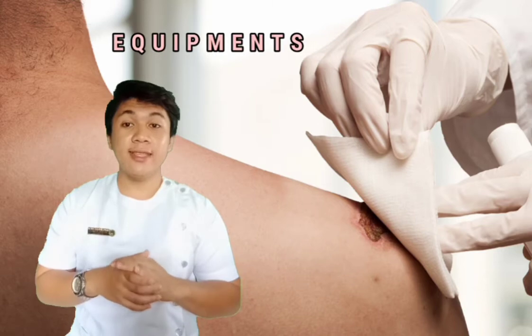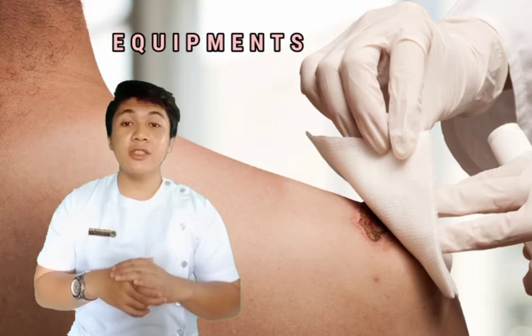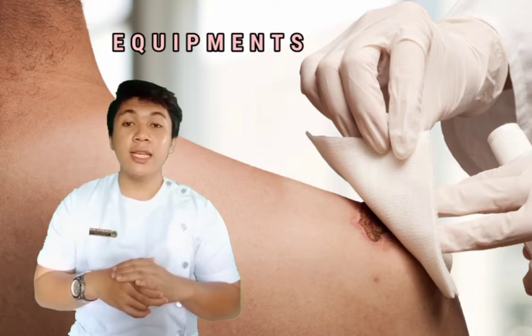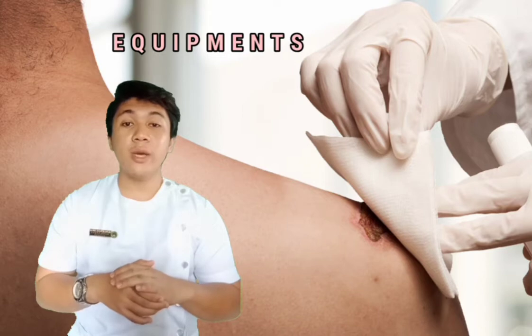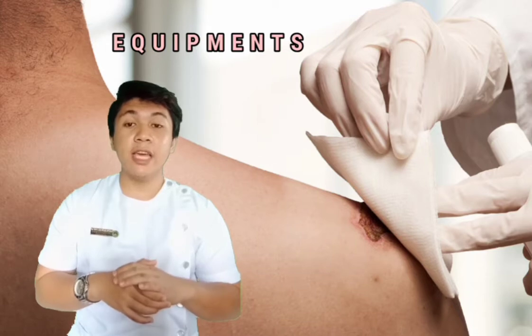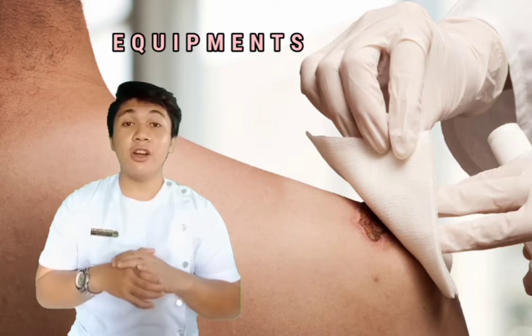For the equipment, a dressing tray containing the following: sterile gloves, gauze dressing, sterile dressing set or suture set for sterile scissors and forceps, sterile cleaning solution as ordered, commonly 0.9% normal saline solution, clean disposable gloves, sterile basin may be optional, sterile drape may be optional, plastic bag or other appropriate waste container for soiled dressing, waterproof pad, and bath blanket, tape or ties, surgical pads or ABD pads, additional dressing and supplies needed or required by the physician order.